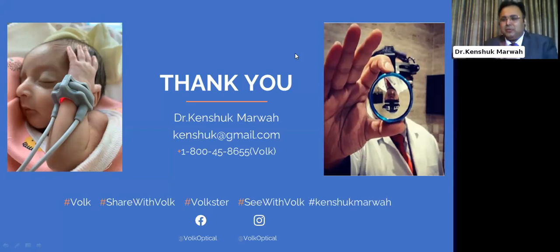So it comes with time. Start with the temporal aspect because that's where you can see the ora. You will get more confident, and then you start to see the nasal side. First see the temporal side, then the nasal side, then go for the inferior and superior aspects. Start practicing with the temporal aspect of the retina. Screen those patients who have come for cataract. In most government colleges now, patients are kept overnight until they are followed up for cataract. Dilate the other eye, see those retina cases, and see them on the slit lamp.